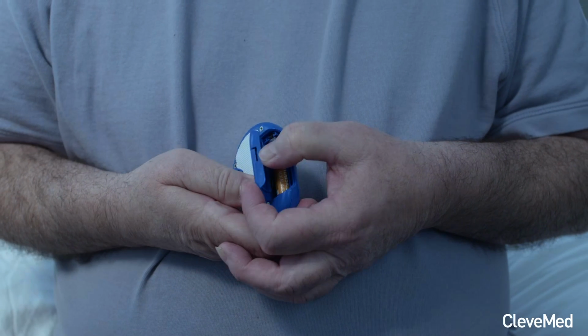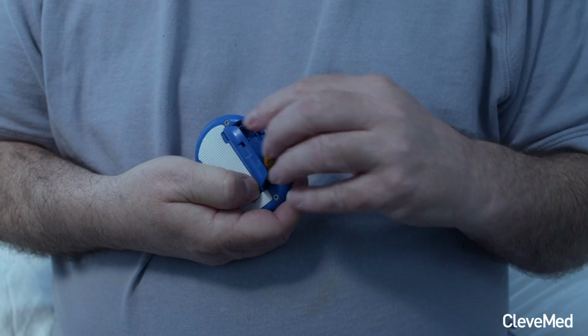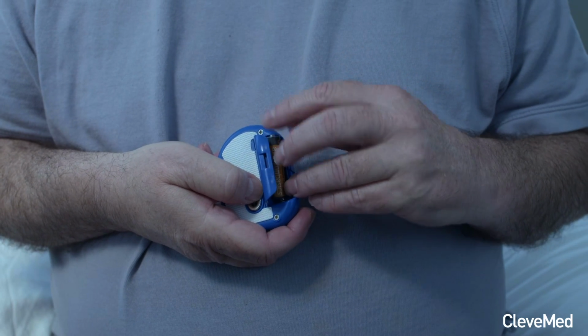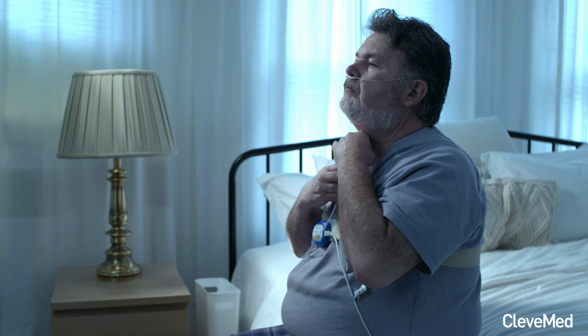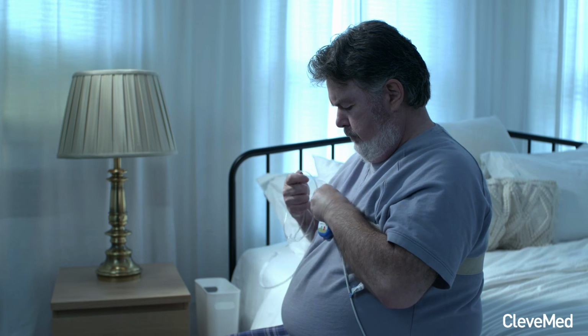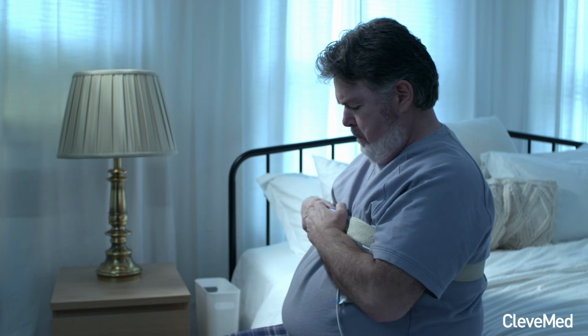If you are using the monitor for another night, you will need to put in a new battery in SleepView. The SleepView Monitor saves all your recordings. Once you're finished with your test, you can remove the device and discard the nasal cannula and belt. Do not discard the SleepView Monitor and pulse ox sensor.